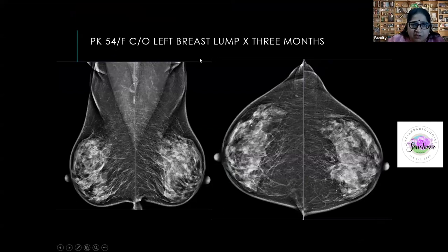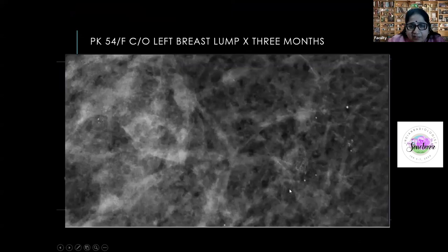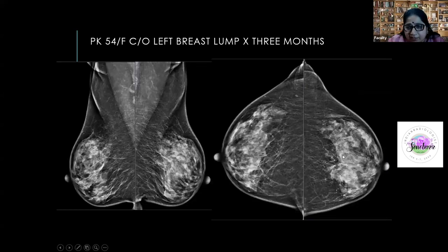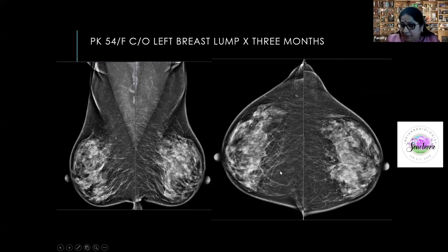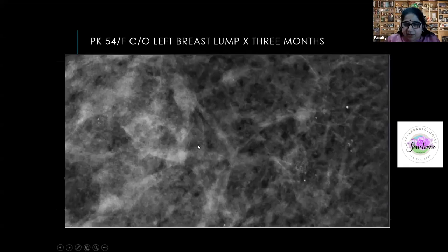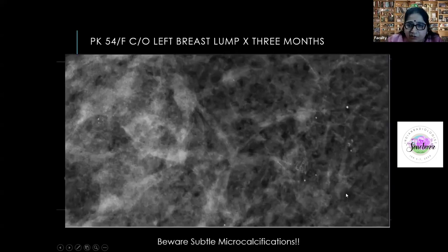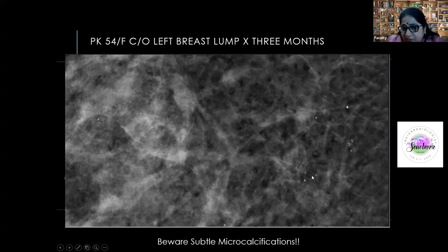Case: A 54-year-old with a left breast lump for three months — just a little architectural distortion visible. But on the right, there are very subtle microcalcifications. If you are focused only on the left breast and not scanning both breasts with a magnifying glass, you will miss subtle calcifications. The left was an invasive ductal carcinoma, but the right-sided DCIS would be missed — the distribution plus fine pleomorphic and fine branching morphology are all suspicious and require biopsy.